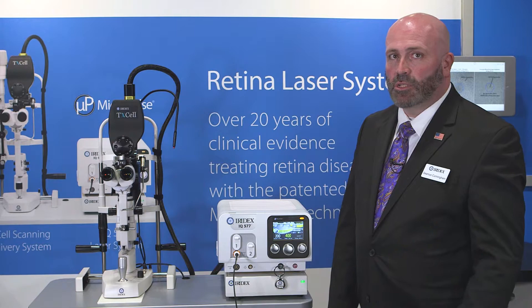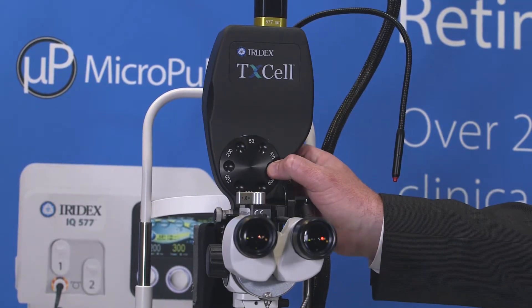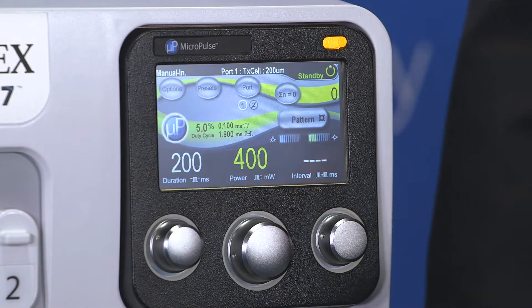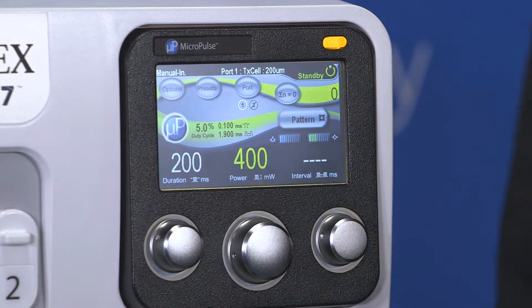The next step would be to select your spot size. The spot size can be selected by rotating the dial on the slit lamp adapter. You can also check the spot size by the black line across the top of the LCD screen — here it says Port 1, TxCell, 200 microns.